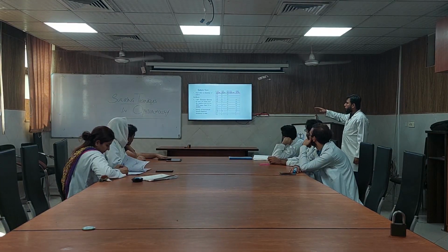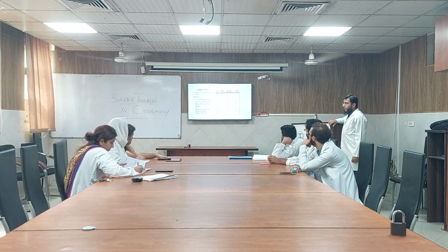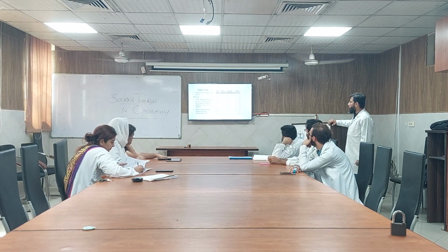Currently, in the modernized, developed countries, metric gauge is superior over the USP because it actually tells us about the millimeter size of the sutures. For example, if the metric gauge is 0.2, the size is about 0.02 mm. We divide the metric gauge by 10 and we will get the size in mm of the suture.